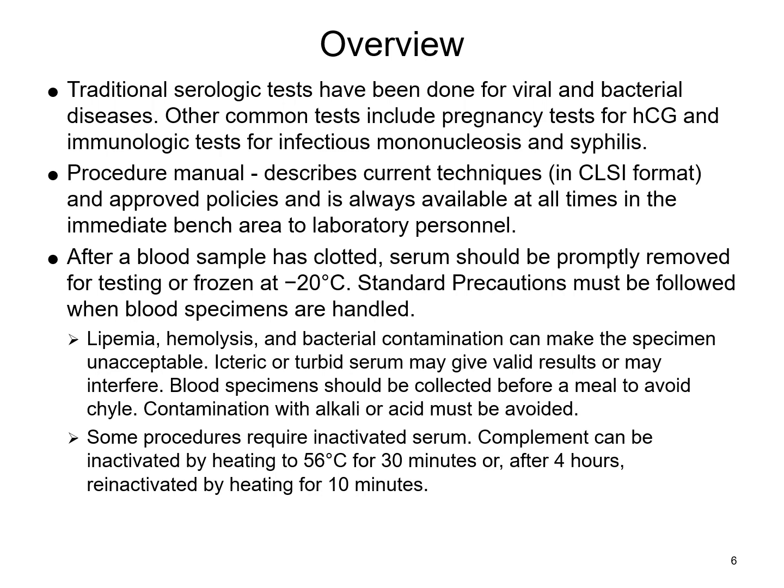other samples, or that may test other samples for something. Examples of this would be urine, testing for pregnancy, or any kind of bacterial contamination or breakdown byproducts.